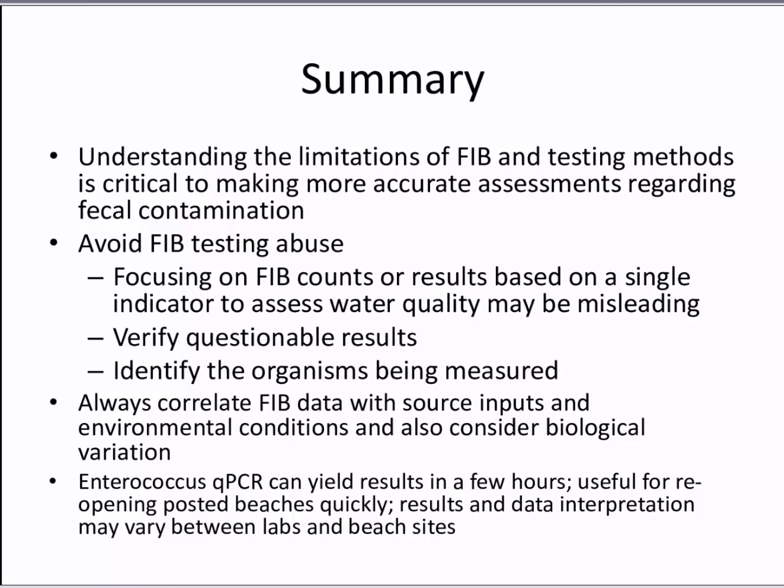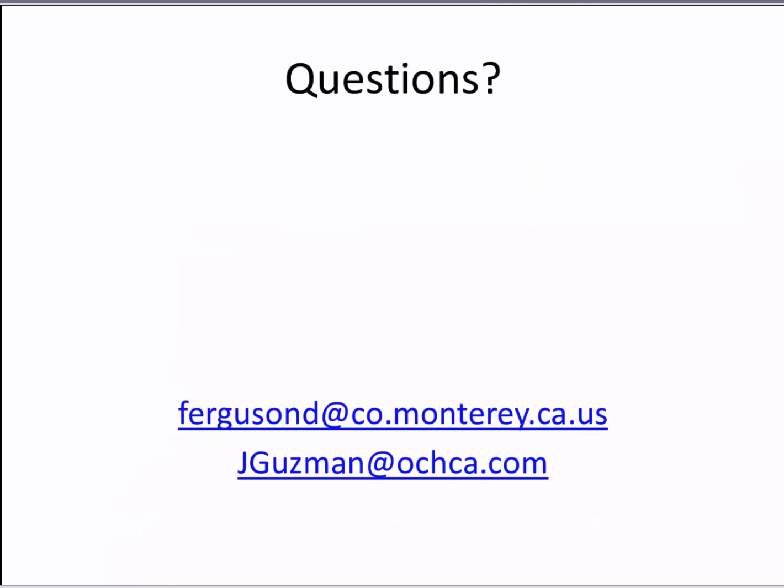Enterococcus qPCR can yield results in a few hours. It's useful for reopening posted beaches quickly, but the results and data interpretation may vary between labs and beach sites. Yeah. So if I had to add an ugly part to the molecular methods, that probably would be misinterpreting the data or maybe using a rapid method before it's been fully validated. Okay, so that brings our presentation to a close, and I don't know if we have time for questions, Eric?